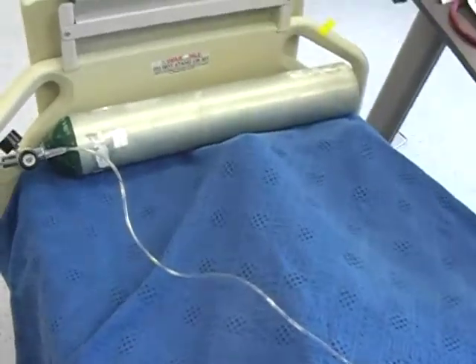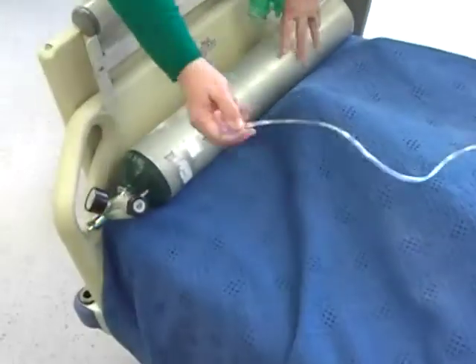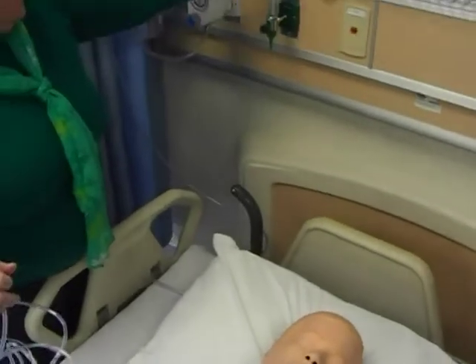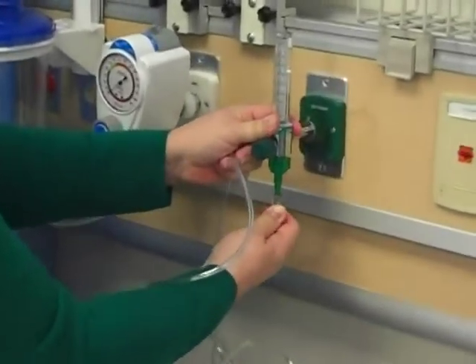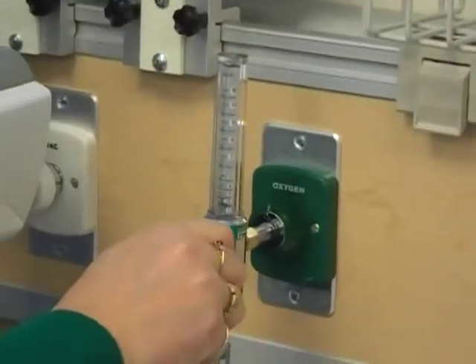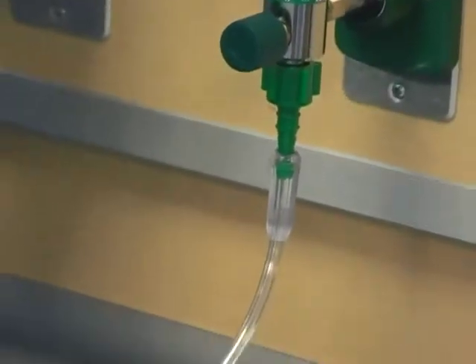Now I want to show you how to connect it to the wall. So again, we're going to have the nasal cannula like we did with the tank, and we're going to connect it to the wall. This is the wall flow meter. You take this end, you connect it — you have to push really hard. And again, I want you to set the flow rate before you put it on the patient. With the nasal cannula, you don't want to go above six liters.